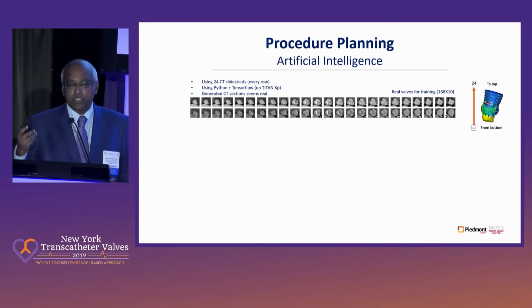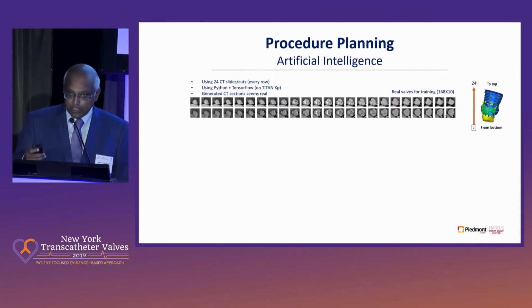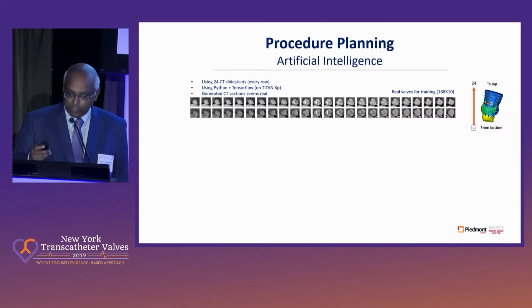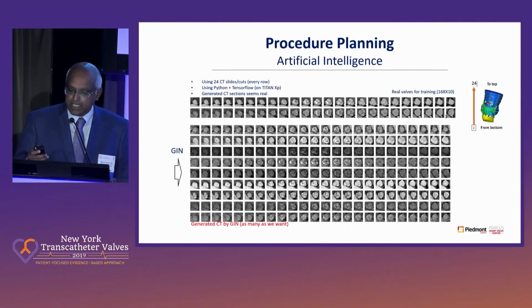We needed 10,000 CTs. We needed 15,000 CTs. You can have it, but even those will never cover the entirety of the anatomic variations in the aortic root. Now we have things called generative adversarial algorithms, which are more complex than neural networks, and which will generate CTs of their own. The computers are so smart, they will generate different varieties of anatomy based on the CT you have provided, infinite varieties from which you can refine your artificial intelligence algorithm to predict PVL.